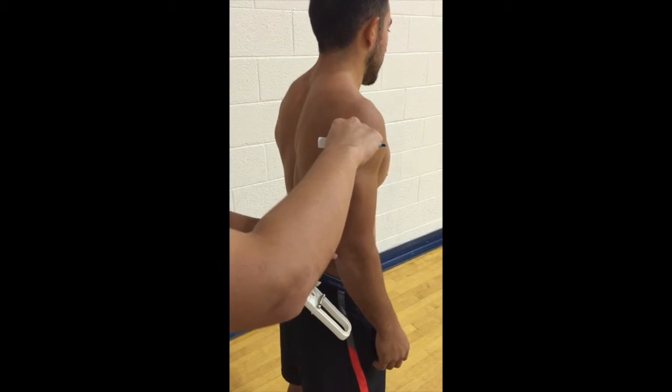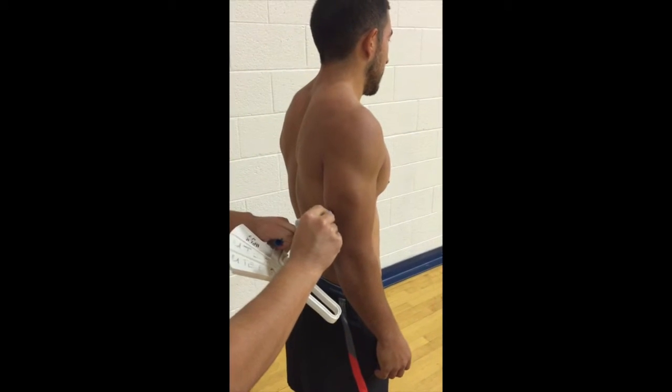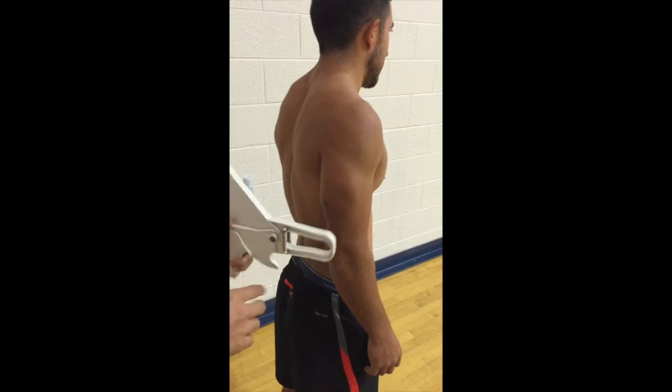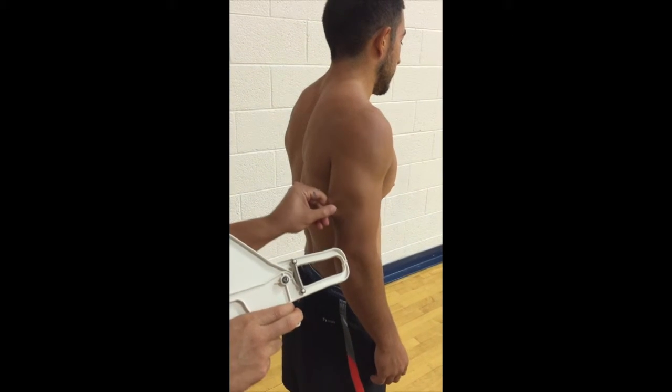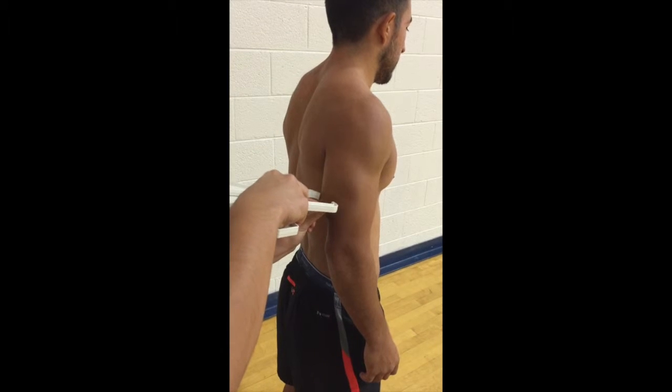The triceps measurement is a vertical fold on the posterior midline of the upper arm, halfway between the acromion and olecranon process, with the arm held freely to the side of the body.